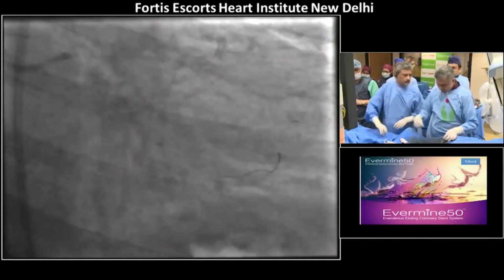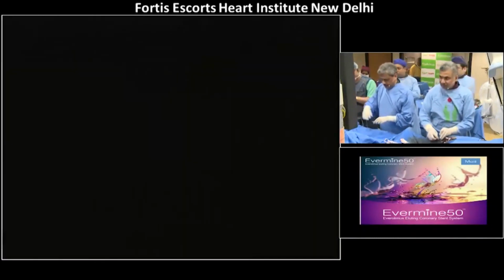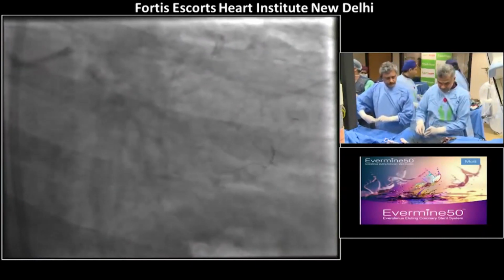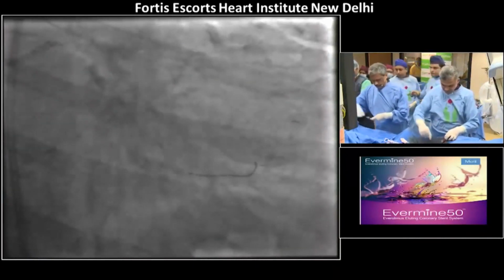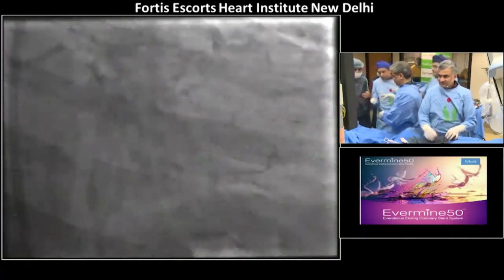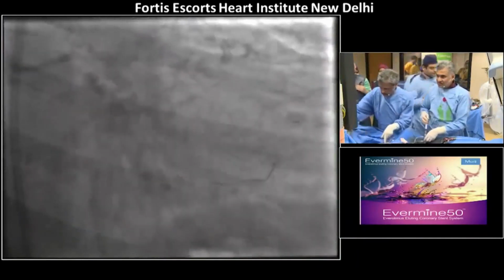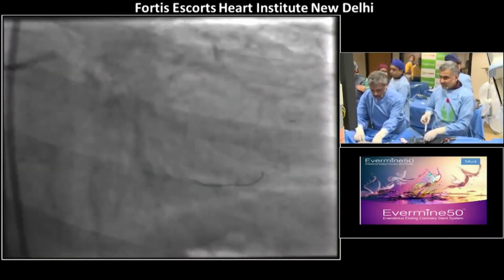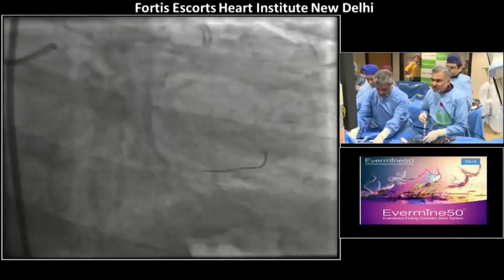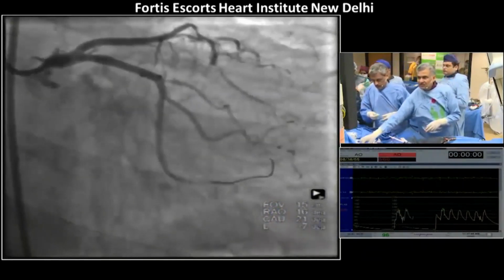Maybe we'll take a focal balloon in case it's not going with me. IVUS ready. So we'll do an IVUS run now. In cases like this where I find a focal underexpansion, sometimes the focal balloon will not expand, but that's a good idea. And the other thing I will often do is take the angiosculpt balloon, which can go up to 30 atmospheres, and sometimes that will release these fibrotic lesions. But you're hoping you never have to do that. Let's see what the IVUS shows.